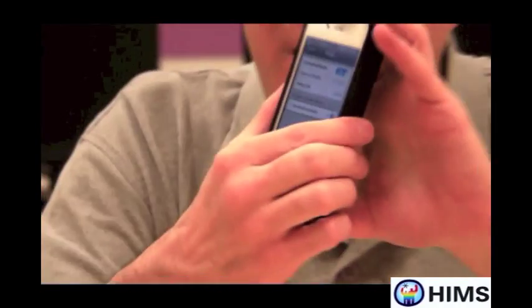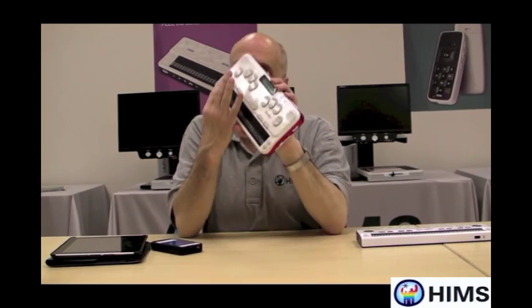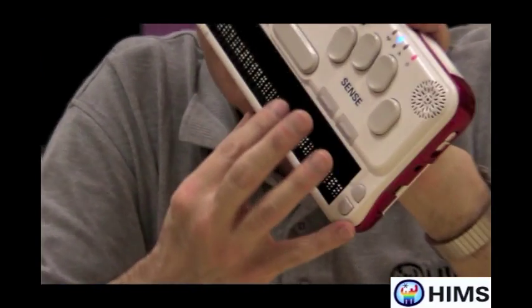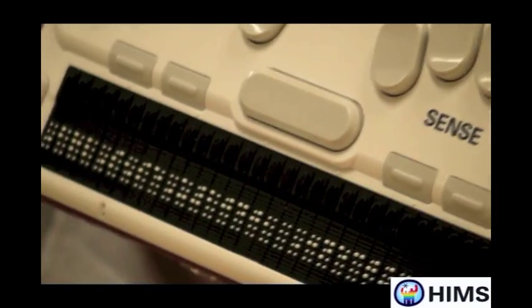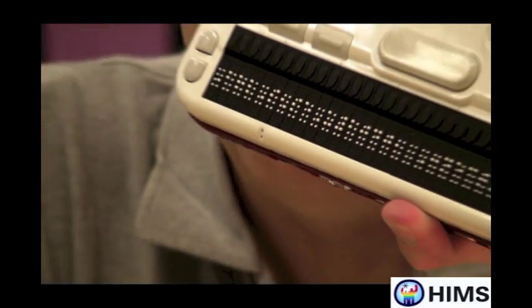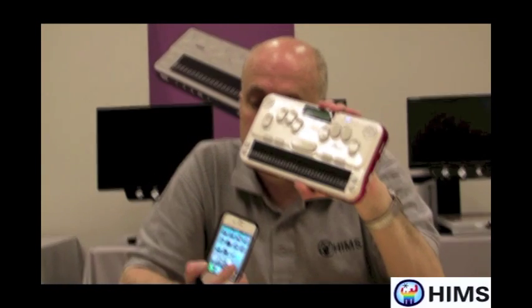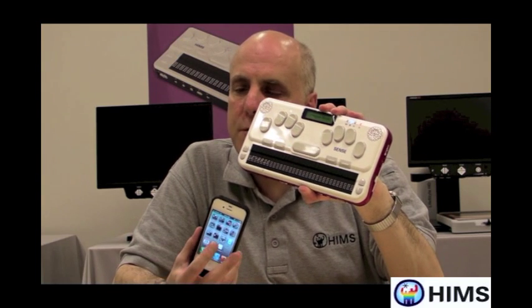So not only do I have my iPhone working, but I have the BrailleSense U2 as a Braille display for the iPhone. As I look at this Braille display, it says 'BrailleSense U2,' lists the model number, and says 'connecting' — and that actually means it's connected. So now I'm going to press the home button on my iPhone.